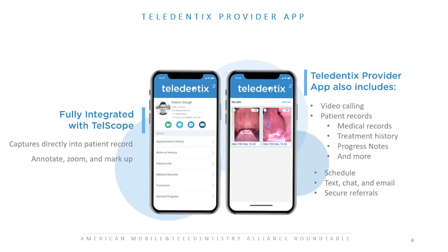So it was great to meet Jennifer. One of the necessary things to complete the ring of teledentistry is the ability to have somebody holding something really in their hand and completing out the patient or provider connection with the software.